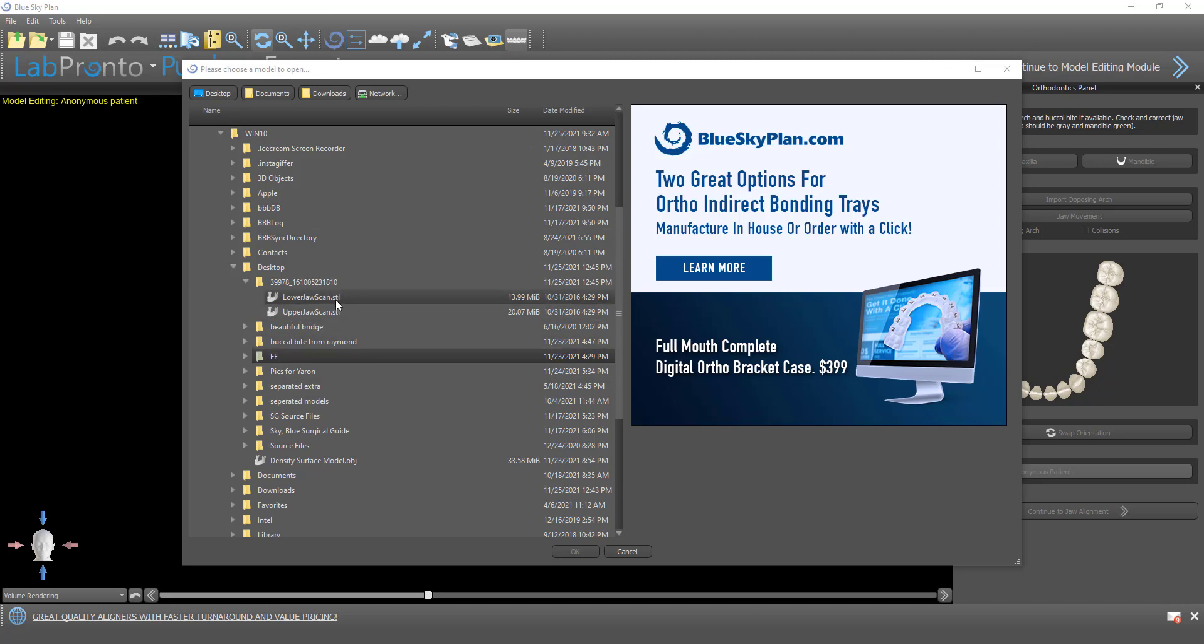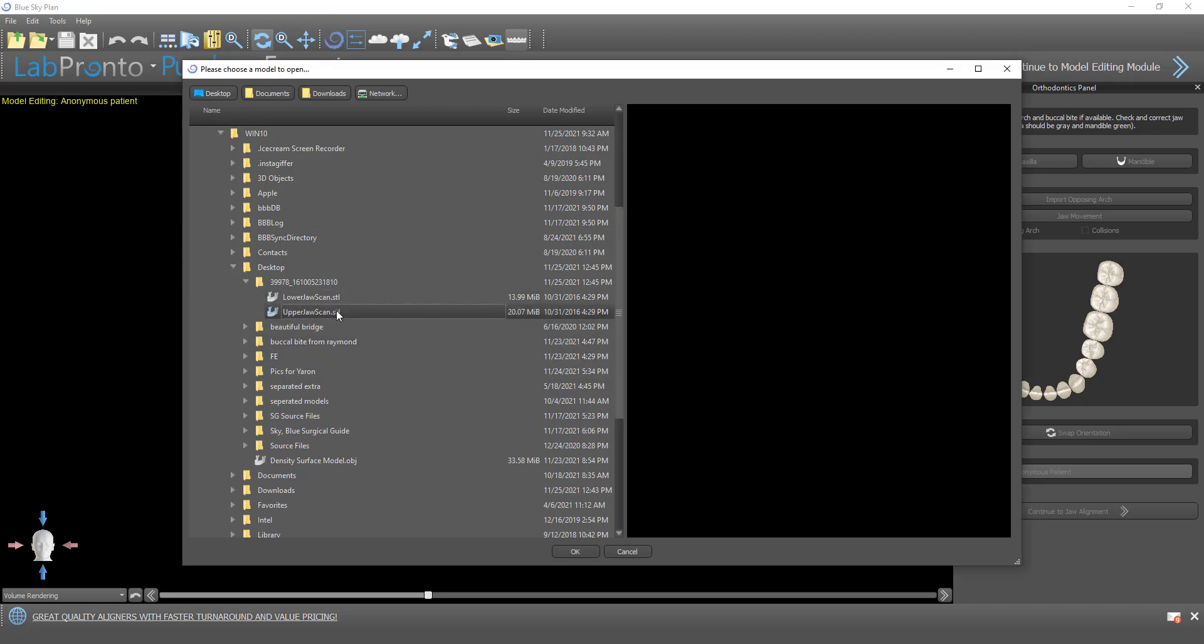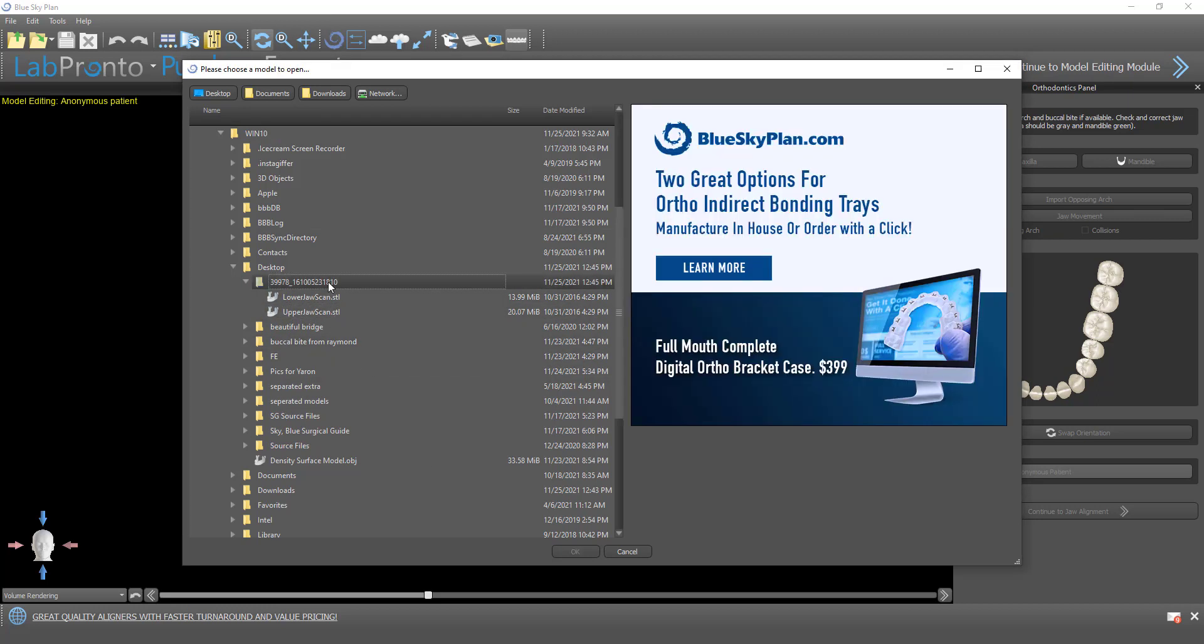I'm going to select the relevant STL files to import. Shout out about our indirect bonding trays packages - you can design it yourself in the Blue Sky Plan software or for $399 you could order a full case that includes the indirect bonding tray together with the brackets, the wires, the digital planning, really everything you need for your full mouth bracket case. You can order that via Lab Pronto for $399.